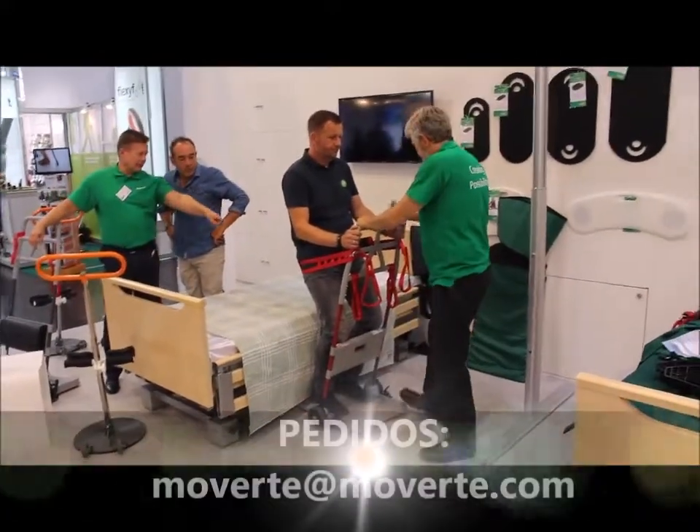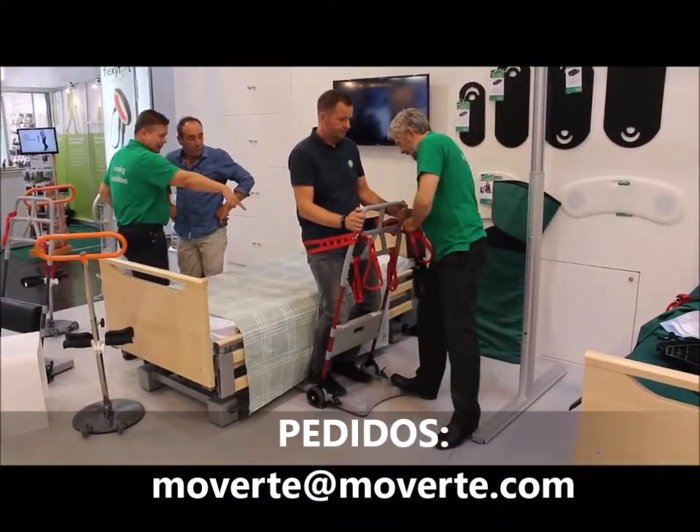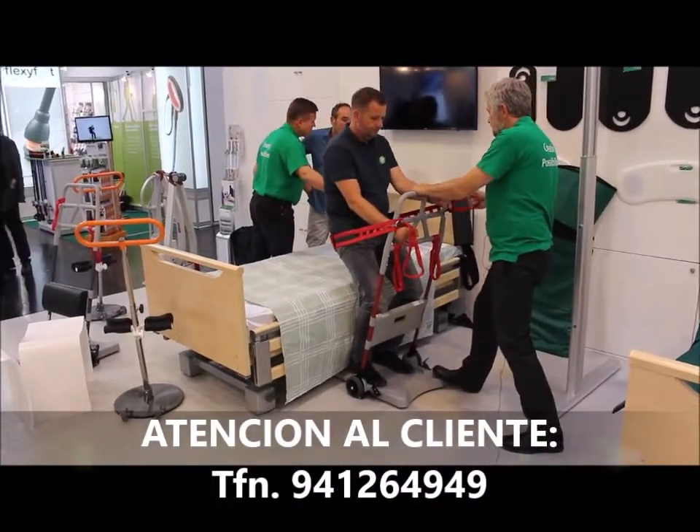Put the brakes on again, loosen him on one side and now I can very easily and in a secure way actually move Michael down into a sitting position again.